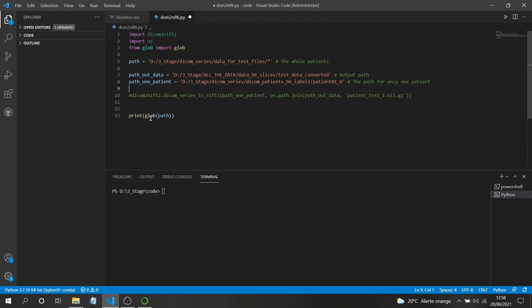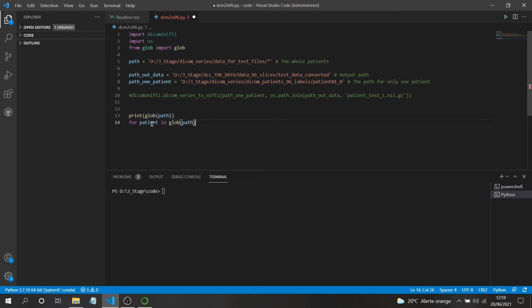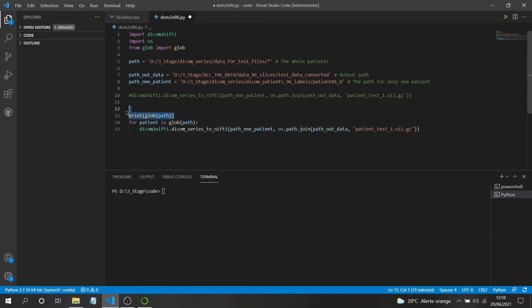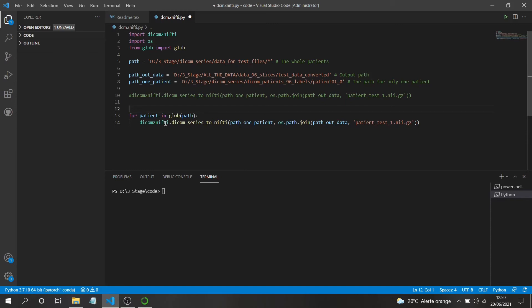Now I'll create the loop: 'for patient in glob(path)' — we don't need a separate variable, we put the glob call directly in the loop. Inside the loop, we call dicom_series_to_nifti with the same structure as before, but now the input DICOM path becomes the patient variable, which changes with each iteration to point to the current patient's folder.